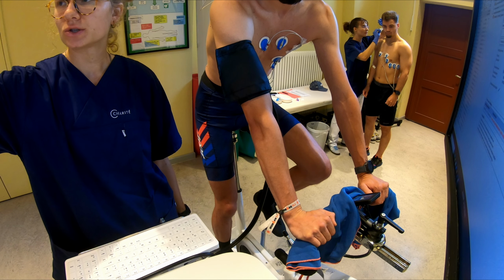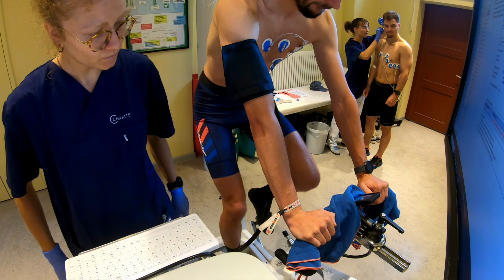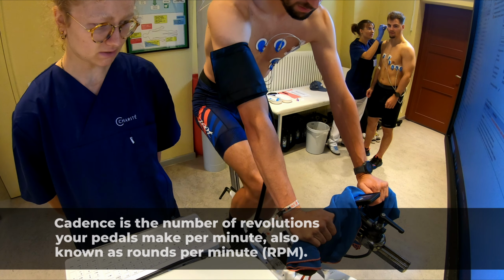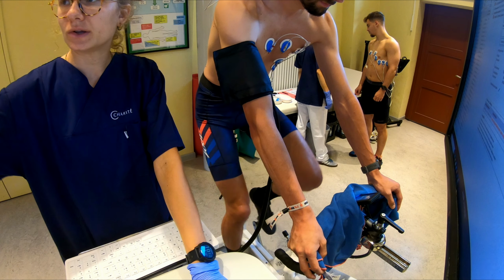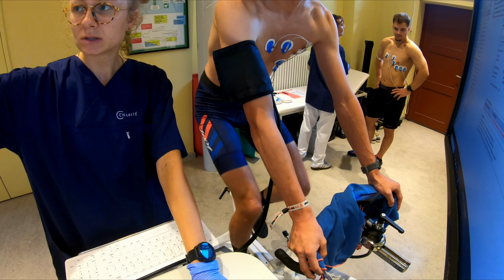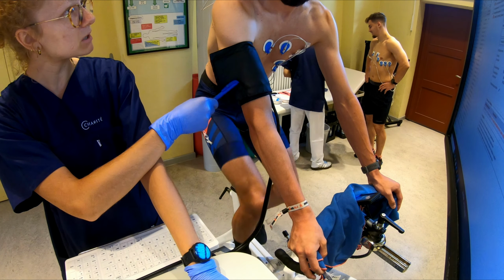Start in 3, 2, 1, and we start push. So 80 power, and here you can see the cadence around 70. Okay. You are not allowed to go lower. That's not lower. Here you can see it counts 3 minutes, and after the half time, 1:30, I'm going to start the blood pressure.